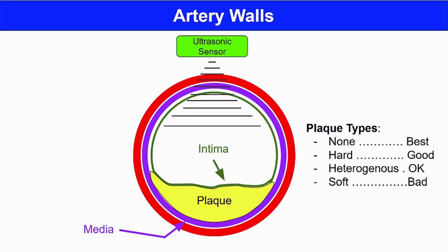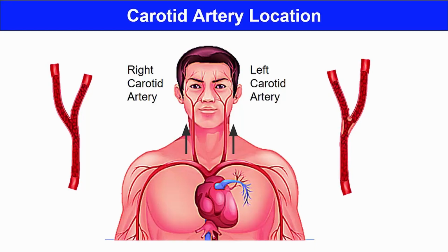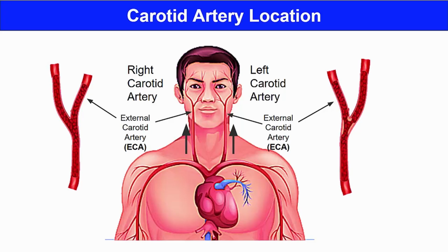How cool is that? The carotid arteries come up from the heart and run along either side of the neck. Just before the jawbone, they split. One branch goes external to the skull, that's the external carotid artery, or ECA, and the other branch goes inside the skull, that's the internal carotid artery, or ICA, which you really can't see on this image because it's up underneath the jaw.